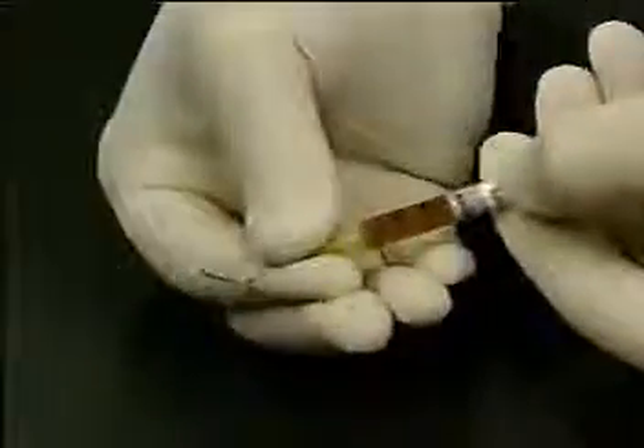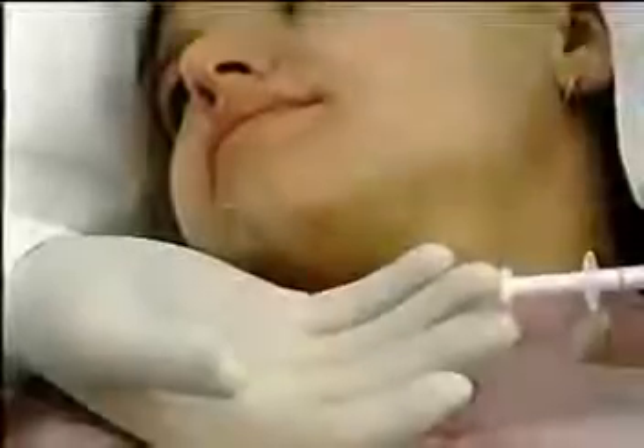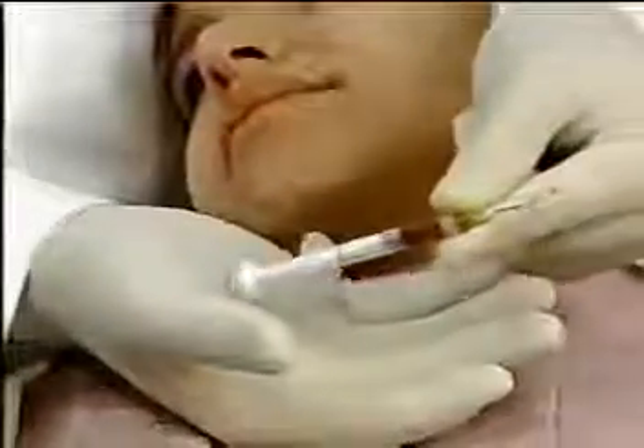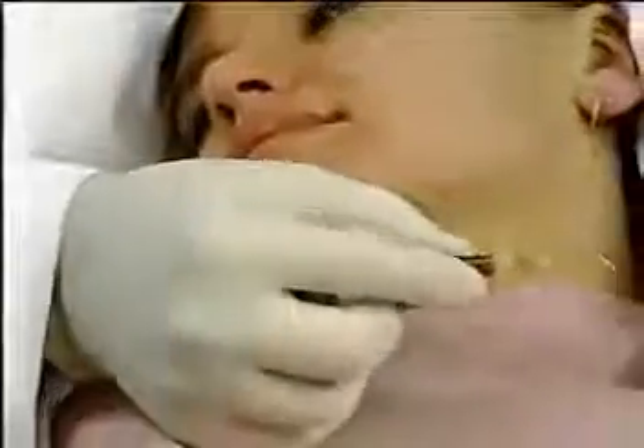A dental infuser tip is now attached to the syringe. To ensure a smooth and consistent delivery of Viscostat, the syringe should be held as shown here, using the palm of the hand rather than the thumb to depress the plunger.